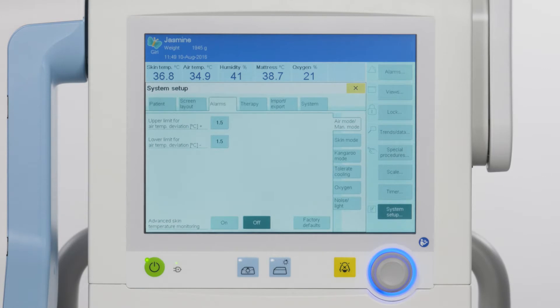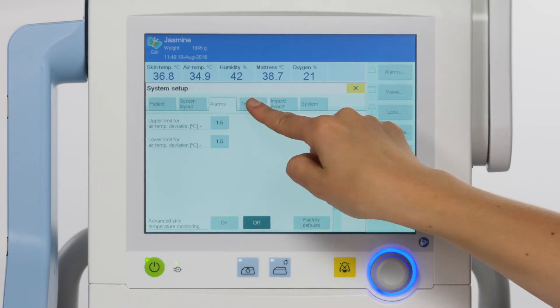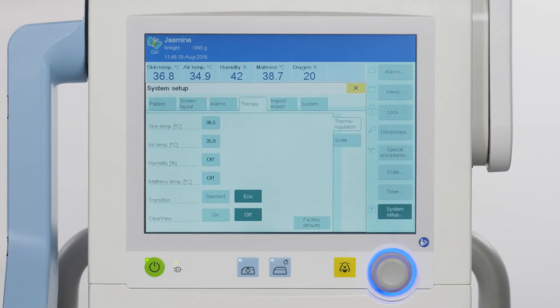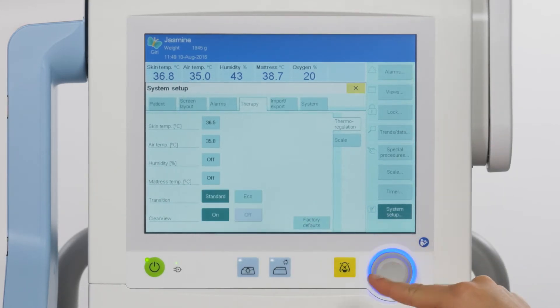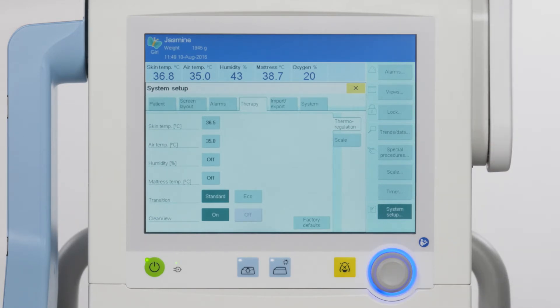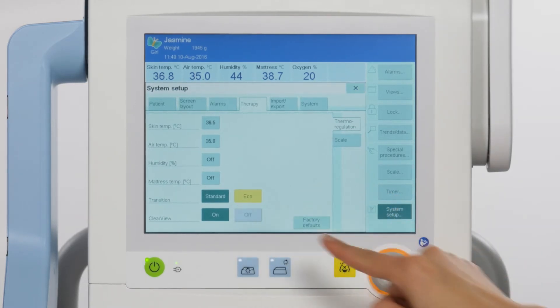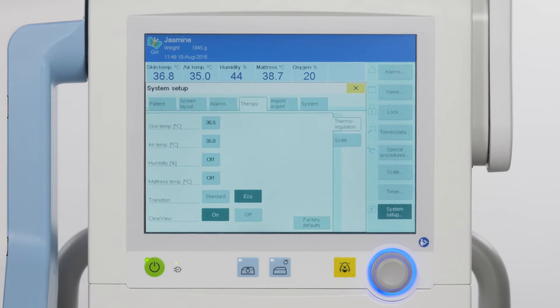Settings selected here will be used as default when the device is switched on. For transition and clear view, keep in mind that when transition is set to standard, it means when in incubator operation the radiant warmer operates continuously at low power, and in radiant warmer operation the convection heater operates continuously at low power. Eco signifies that when in incubator operation the radiant warmer is switched off, and in radiant warmer operation the convection heater is switched off.